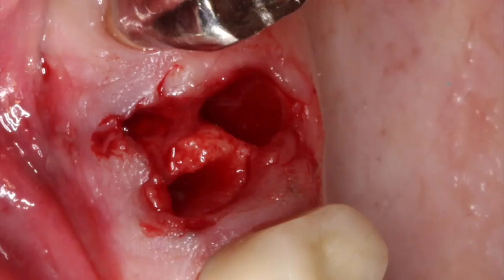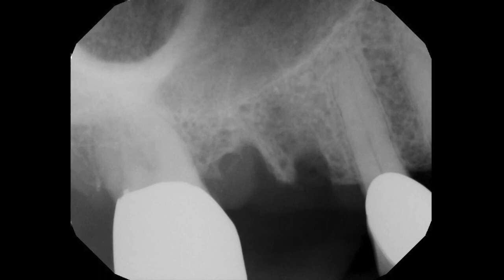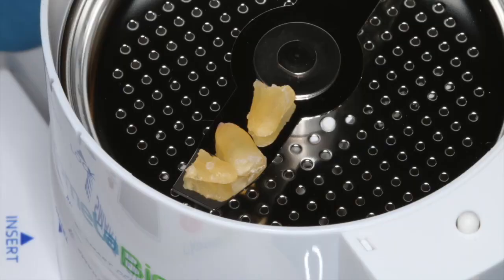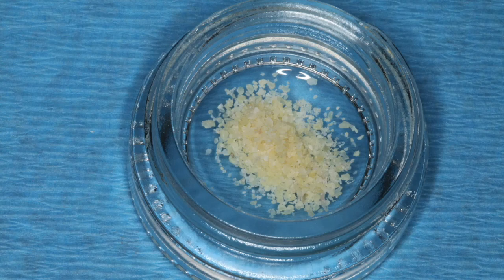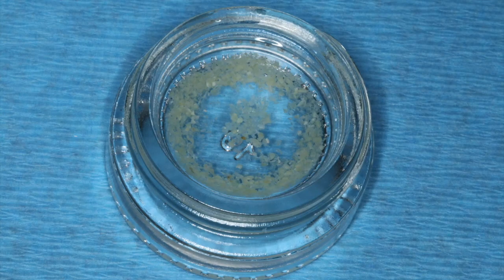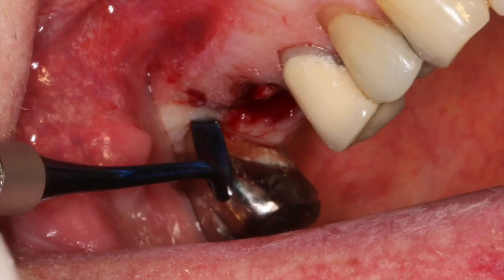Going through the same process illustrated earlier, I'm going to take the coronal portion of this root out, then clean and scrub those root structures. I'll place them in my dentin grinder — look at the amount of particulate we receive from those three little roots. We then go through the process of cleansing for about 10 minutes and remove the excess material. We have a membrane that is cut to size to protect the graft from invagination of epithelium. We're going to flap this area so that I can see if there's any defect, using the Golden Dent orban knife.